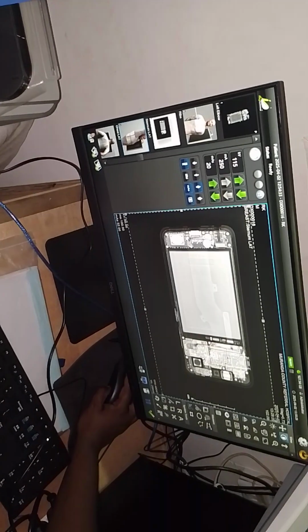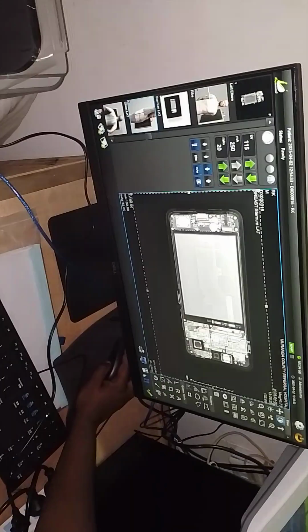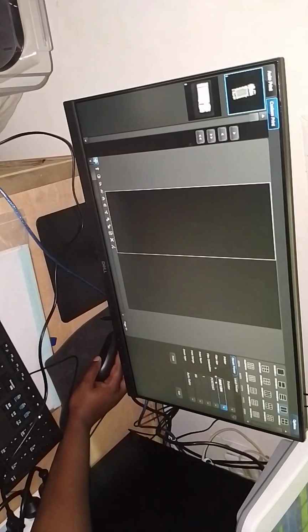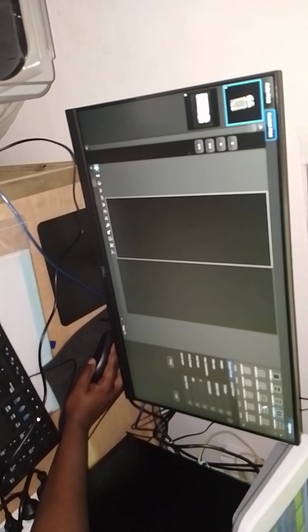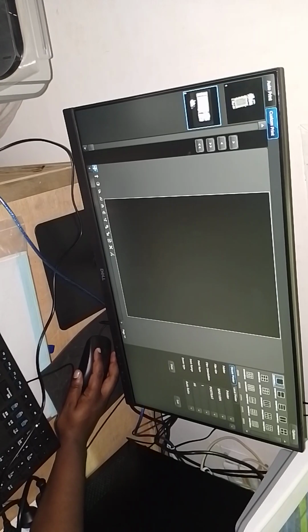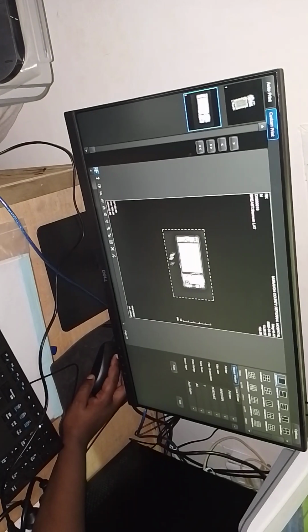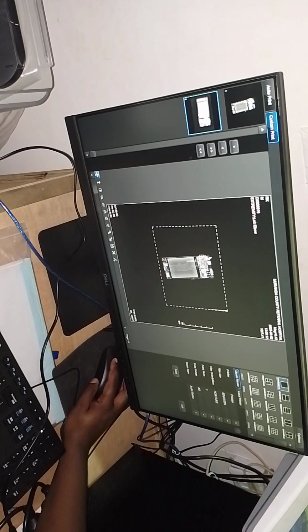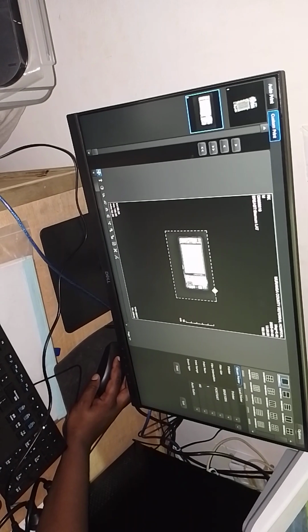Before you do that, if you need to print this image, we can also save the image. You press here to save. You can come here, and from there you can select the orientation of your film, and then you can drag the image. You have the image there. Now it's set to only print one image.